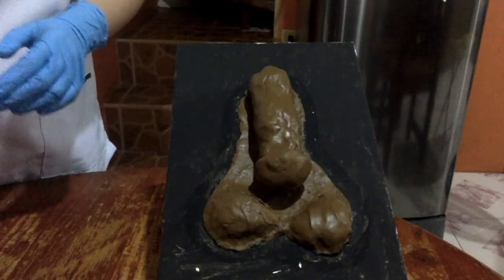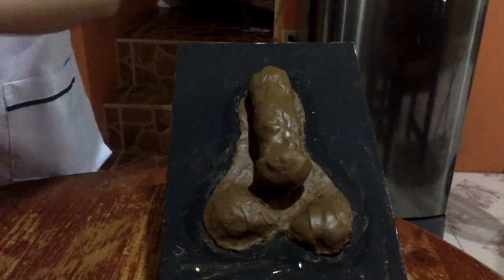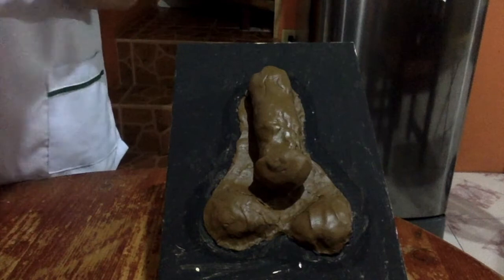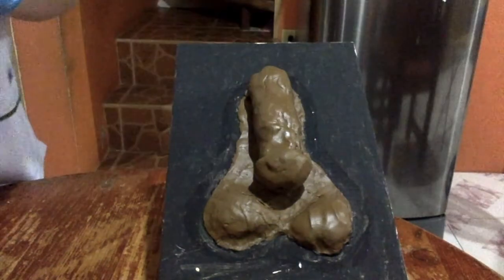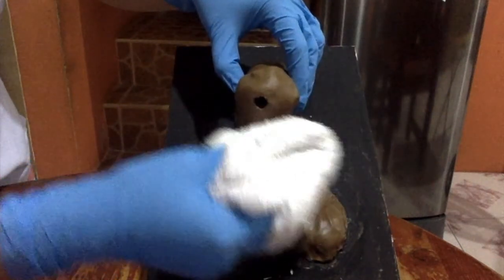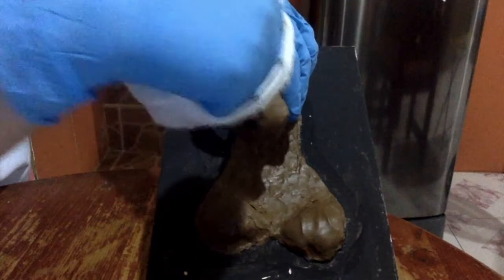Then lastly, the third towel for drying. Just pat it.